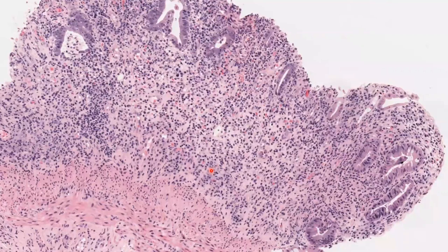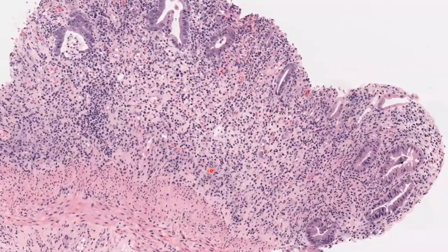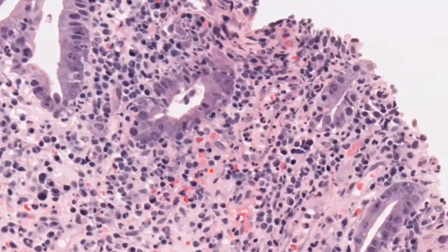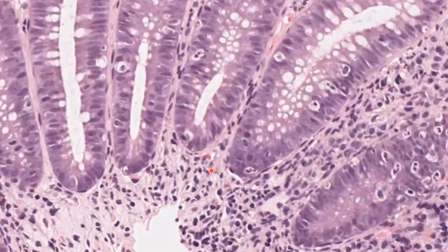When you get other biopsies with acute inflammation, this entertains the surgeons more, because it highlights the acute pouchitis, and it gives them license to give antibiotic treatment. But you have to score it according to the severity. I also wanted to highlight the crypt shortening, architectural distortion, and crypt dilation. You can get all of these features, yet you cannot give me that diagnosis. Here you have a crypt abscess, which will upstage your pouchitis, okay?